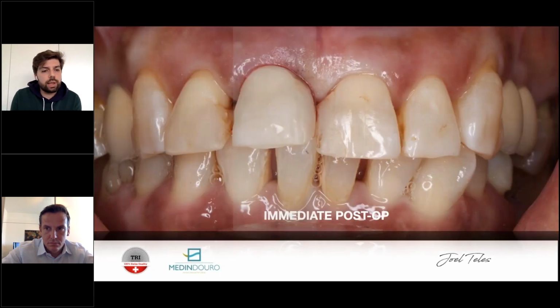So back to our initial case, and you can see here the immediate post-op, and of course in the immediate post-op the situation is exactly the same, but you can see that the tissue is more or less unharmed. Okay, so the possibility for good healing is better.